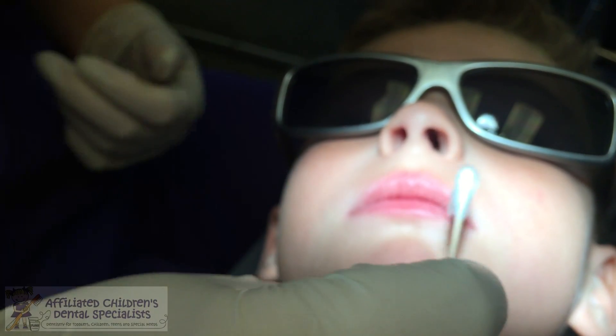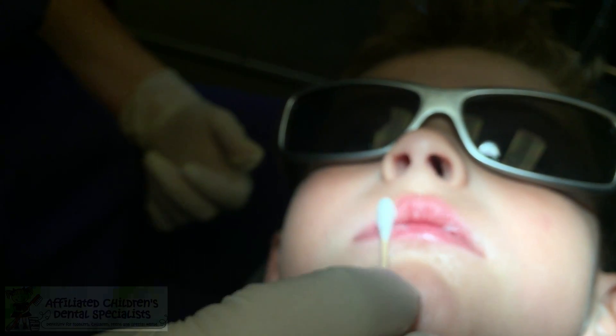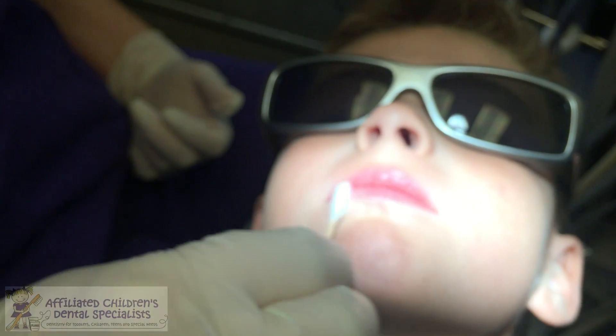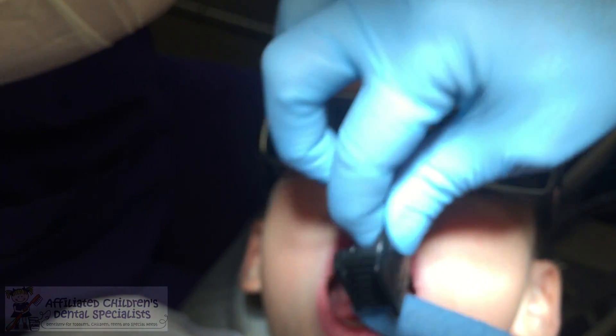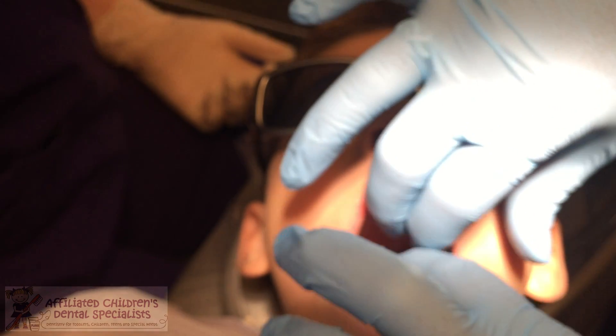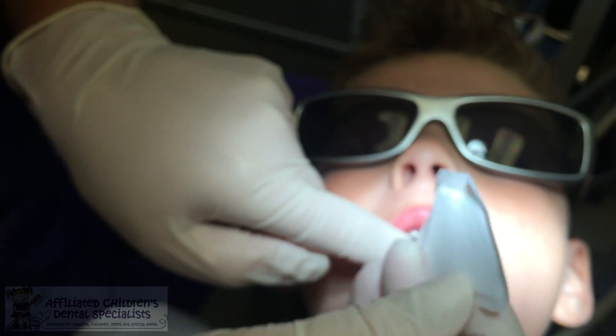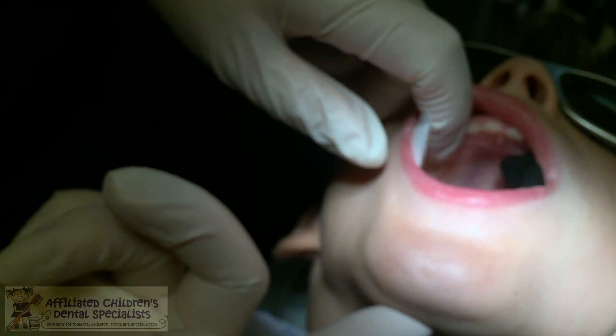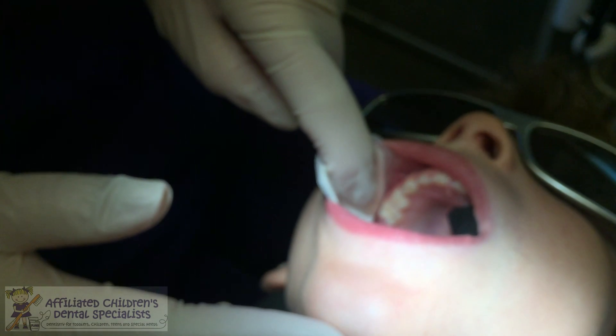We'll use pumice, and now I'm going to put some Vaseline on your lips because I don't want the medicine to accidentally stain your skin. So we're going to put Vaseline around your lips, and this makes a nice barrier so you don't accidentally give them a temporary tattoo with the silver diamine fluoride, or the SDF. And now we're going to put a little pillow in your mouth to help you stay open nice and big, and then I'm going to put a little cotton to help keep your cheek out of the way. Can you lift your chin up to the sky? Look at our beautiful ceiling.